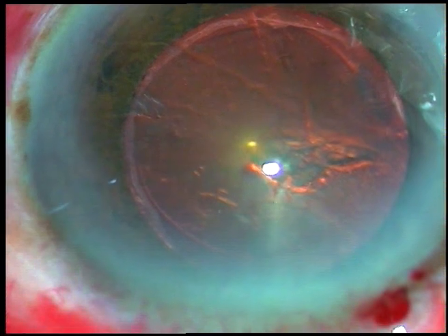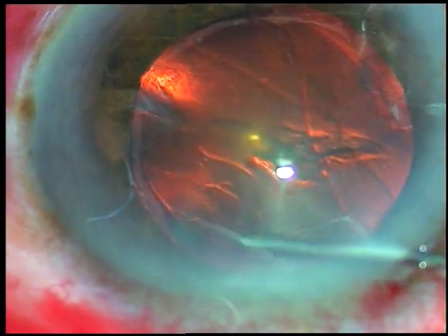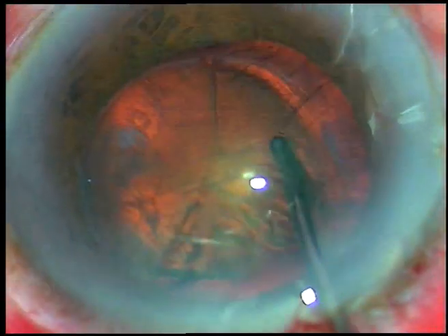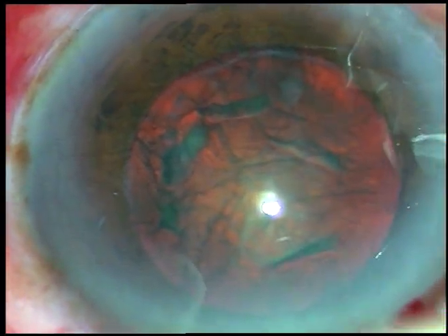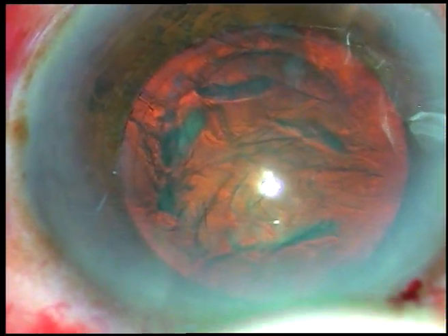Now hydrodissection is to be done. Since there is good red glow in this case, you will see the fluid wave. It has gone from 1 o'clock towards the opposite equator, that is 7 o'clock. Now the nucleus is depressed and it is rotated.